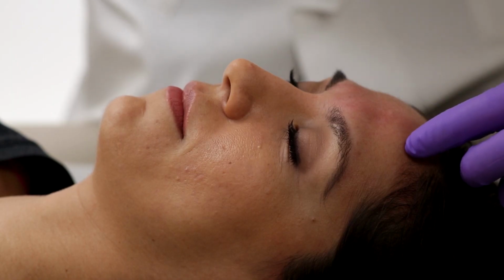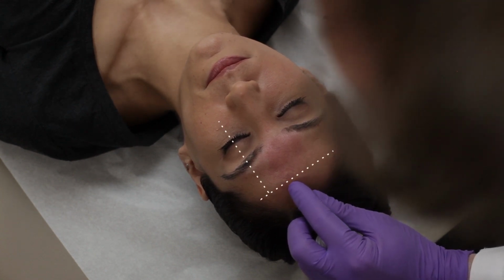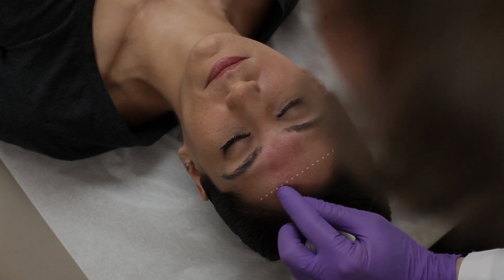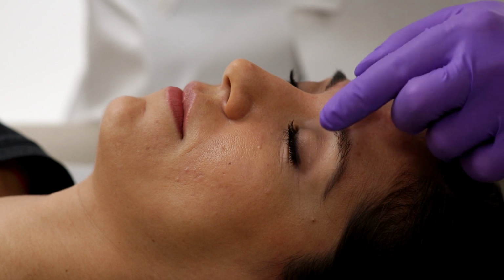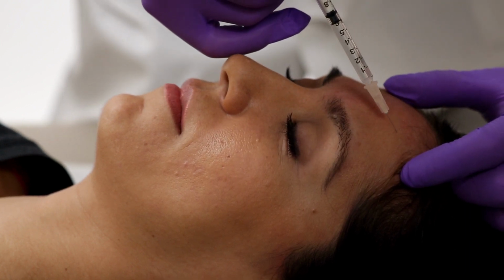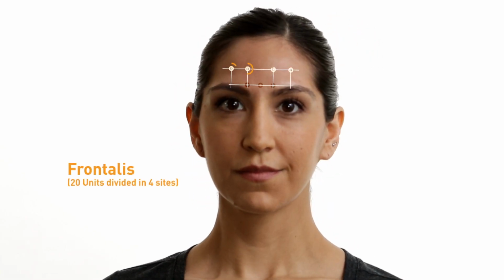The next injection is just lateral to the medial injection. Visualize a line from the middle of the supraorbital ridge along the same horizontal line as the first frontalis injection. This will be at least 1.5 centimeters, or approximately 1 finger's breadth, away from the first medial injection, and may line up vertically with the mid-pupillary line. Point the needle at a 45-degree angle and stay superficial. Stabilize the hub of the needle and inject. Repeat this procedure symmetrically on the contralateral side.